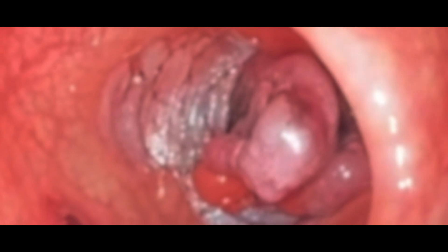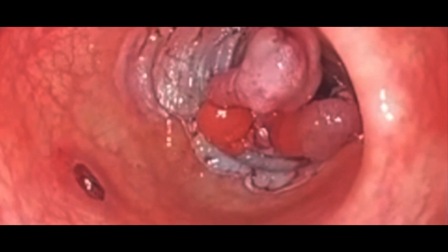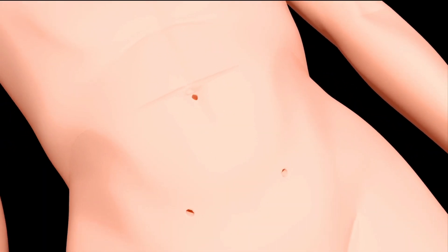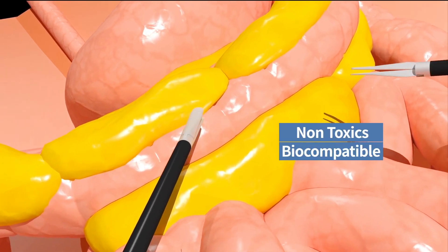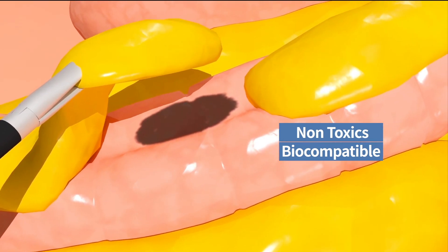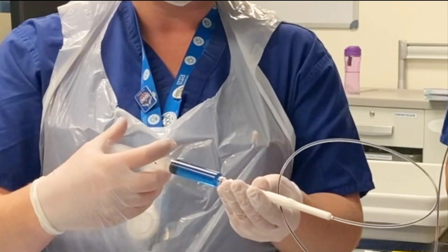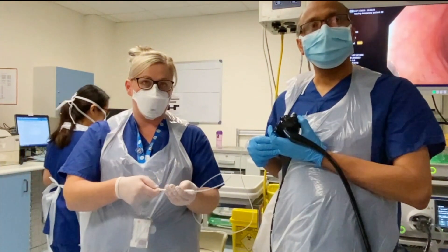We have a difficult situation here — we now encounter significant invasion, so we're going to place a tattoo that will form a marker for our colleagues when they go in to remove this in a radical fashion. I'll show the technique of how we place a tattoo. We will inject and create a submucosal bleb with a normal injecting solution — needle out.